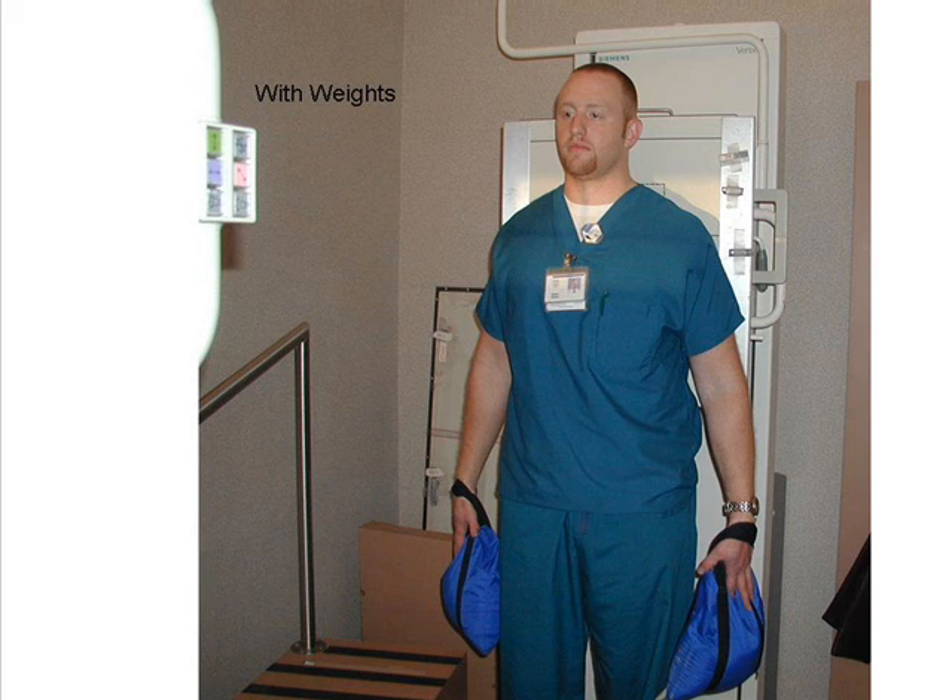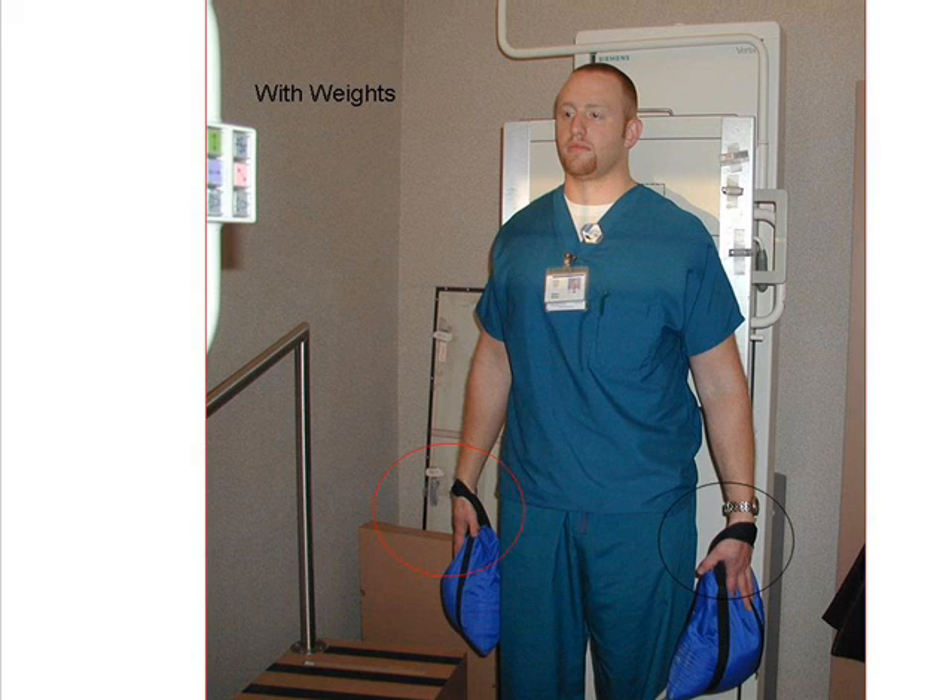Make two exposures: one without weights and the second with five pound weights attached to each wrist. You may make this exposure on a 14 by 17 inch or an 8 by 10 inch image receptor, depending on the body habitus.